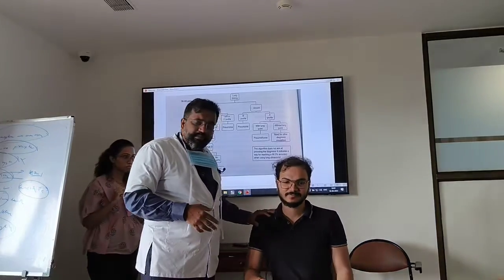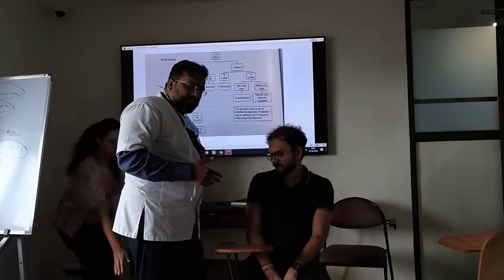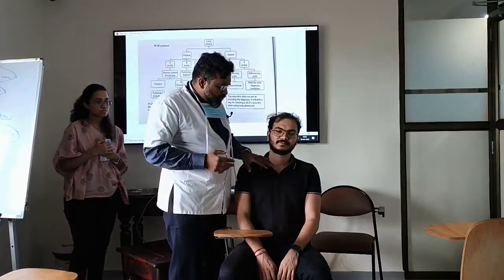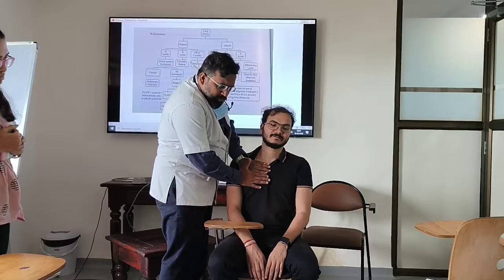When a person is semi-recumbent or sleeping, you keep the blue hands, the doctor's hands. That's what we say. The little finger has to be joining the clavicle, like this, and it should be just touching the sternum. The thumbs are not counted in this. Then you put the thumbs right here.